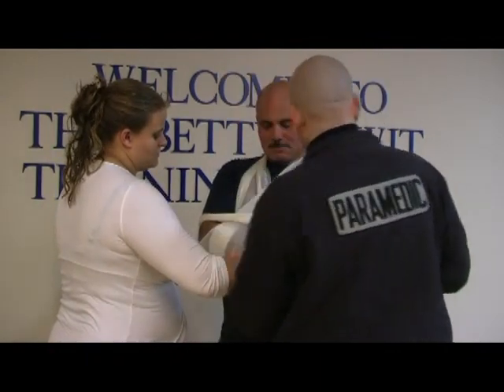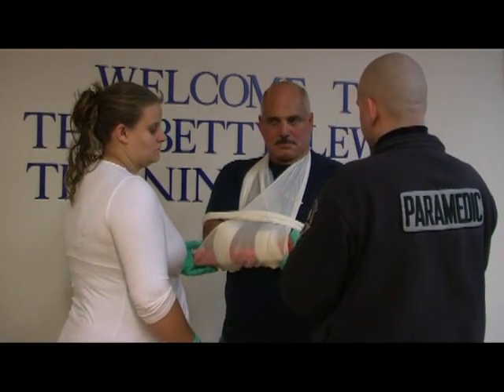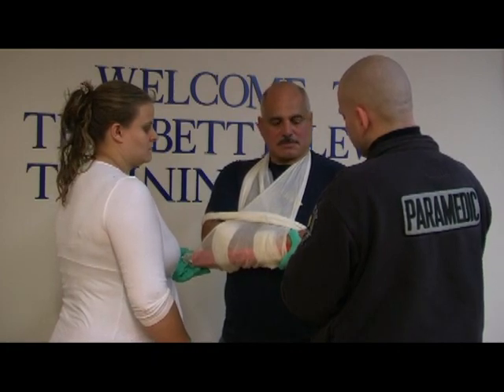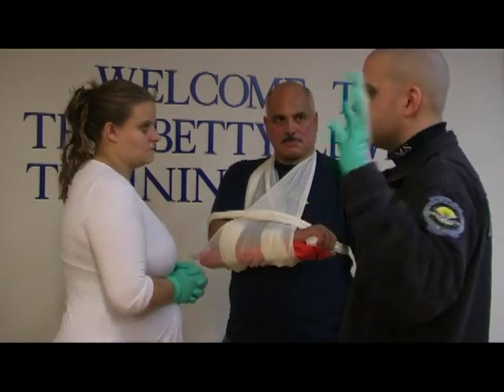I'm going to reassess PMS. Check for presence of a distal pulse. Can you feel me touching your finger? Yes, sir. Which finger am I touching? My next finger. And can you wiggle your finger? Good. The injury is secure. The fracture is stabilized. And I'm done with the station.